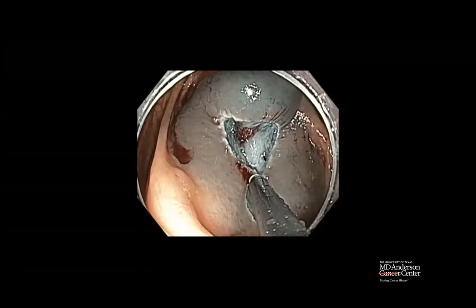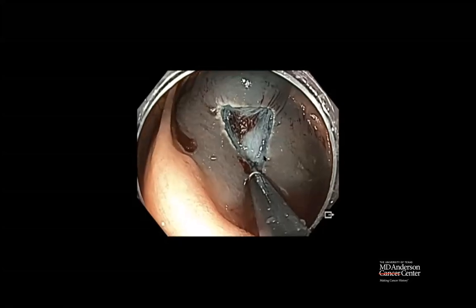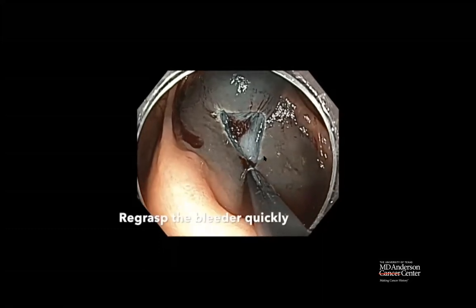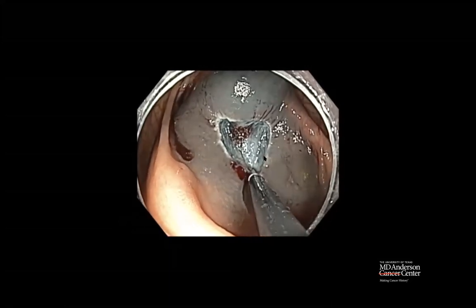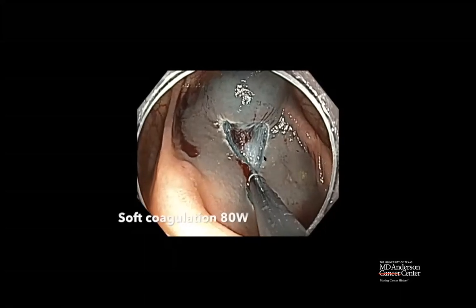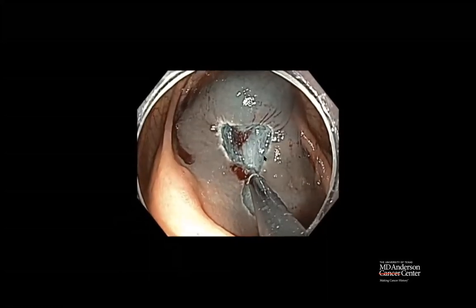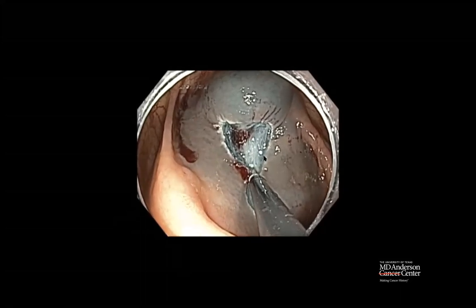And one thing I want to make a point of here is, when you're using a thermal modality device and you want to control bleeding, once you control bleeding, you pull back a little bit and watch. And if it continues to bleed more, you just push it back and apply the current. Don't pull your instrument back into the channel and waste your time trying to go back and find a vessel. You can see that we pulled back a little bit and then went back and applied the current.